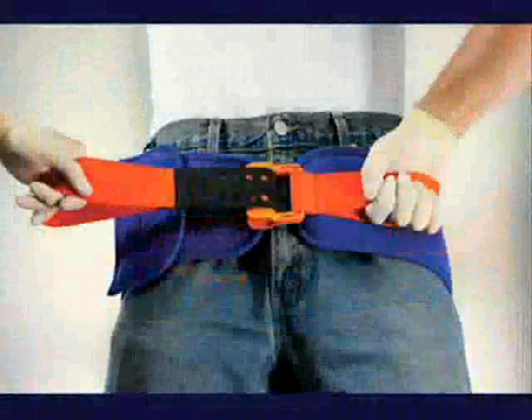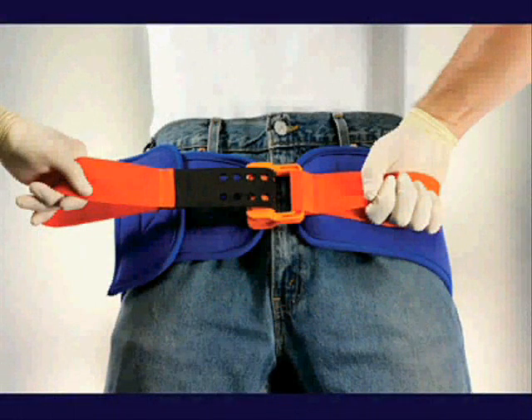The SAM Sling is the first and only force-controlled circumferential pelvic belt designed to provide safe and effective reduction and stabilization of pelvic fractures.